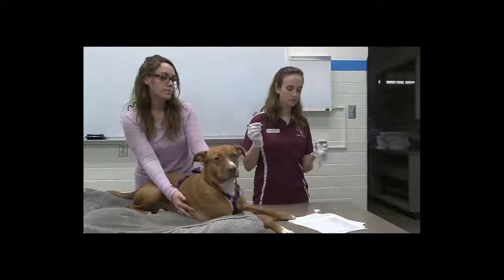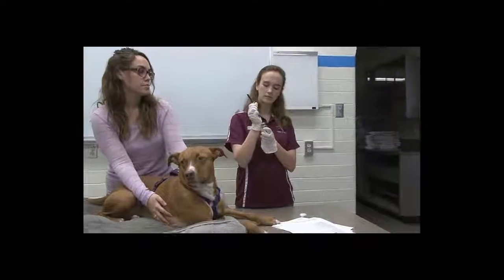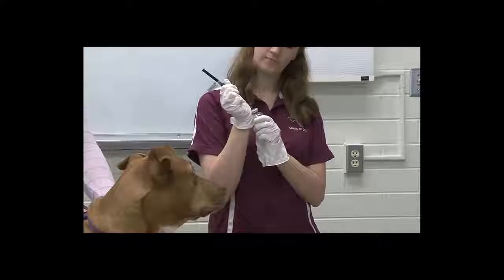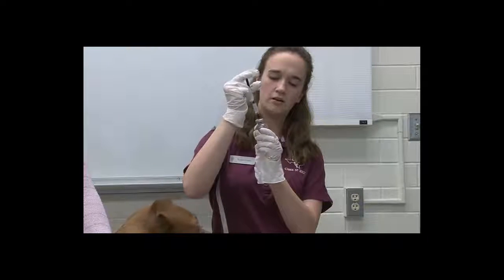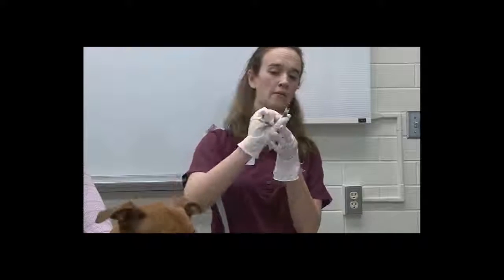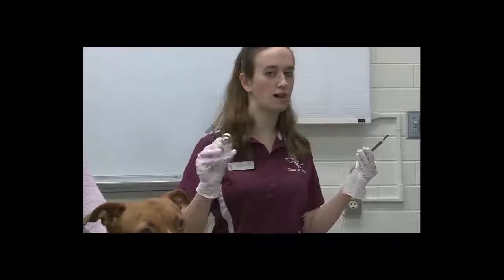So you put your cap down. You're going to take your bottle with the powder, insert the needle, and push the plunger down until all the liquid is in there. Then you pull this out, and you don't re-cap it, but you just are careful that it's not pointing at someone where they're going to walk into it or anything.